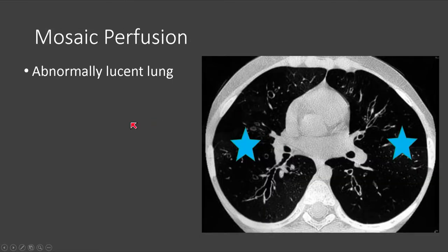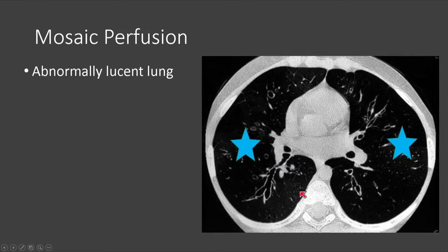Mosaic perfusion, on the other hand, represents abnormally lucent lung. We can see here that the lungs are far too lucent, with a paucity of vessels. The vessels are too small in size, and the lungs are diffusely hyperlucent. This is widespread mosaic perfusion.